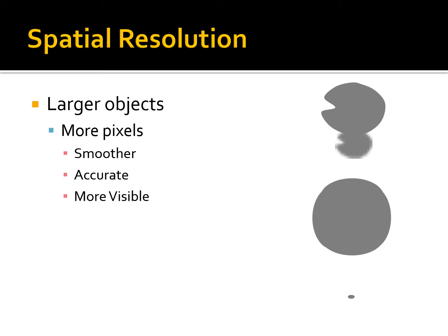Notice that the smaller object is not rendered accurately when magnified. It appears blocky and blurry. In computer graphics terms, this blocky appearance is called aliasing. This is because the image is made of many fewer pixels than the larger version and cannot be accurately displayed without pixels becoming visible when it is magnified.